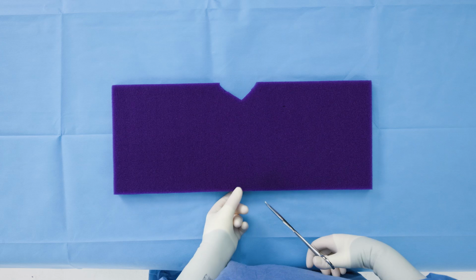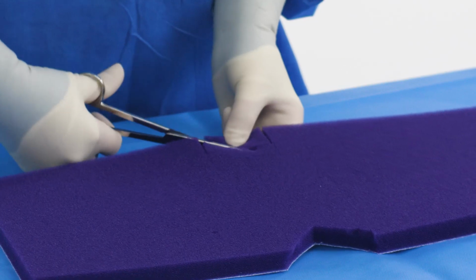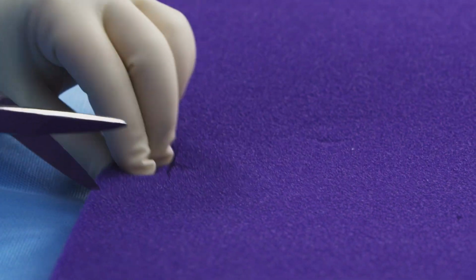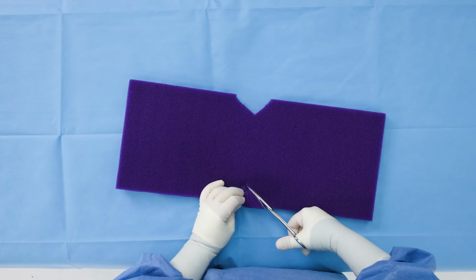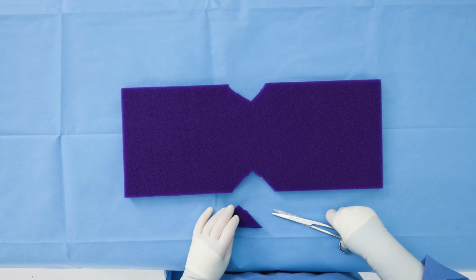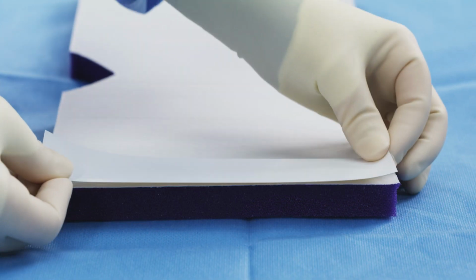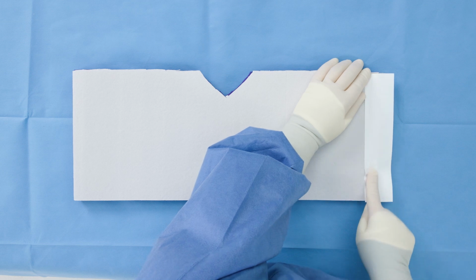3M Prevena Restore Adaptiform dressing allows for customization with an expanded coverage area. Cut the foam dressing away from the incision to avoid particles from falling on the incision. To improve contour on challenging areas, cut wedges around the foam as needed. Place sealing strips on the white side of the foam at the top and bottom of the hourglass.